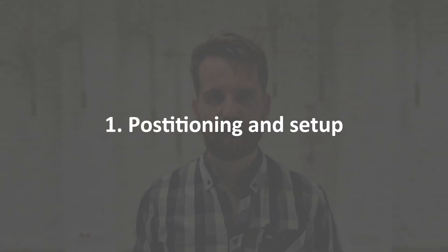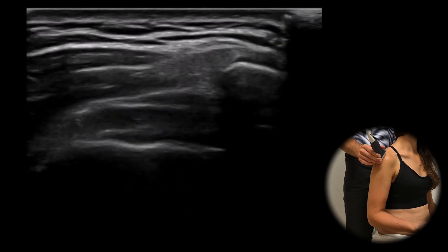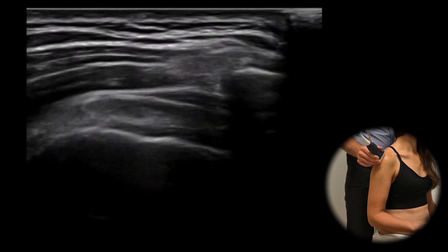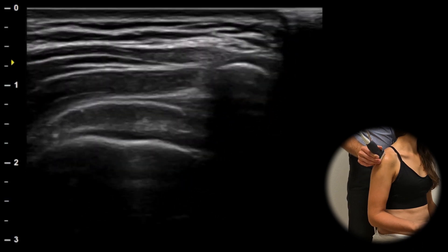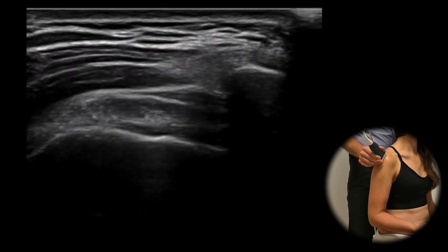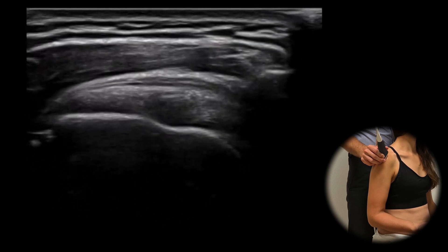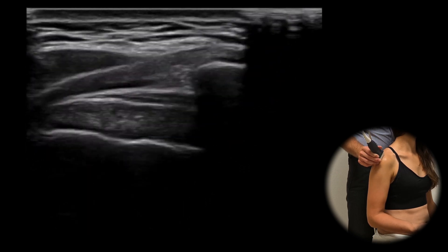Positioning and setup. For this exam the patient is seated with the elbow slightly flexed. To capture the best image we will position the ultrasound probe between the acromion and humerus, aligning it along the long axis of the rotator cuff.